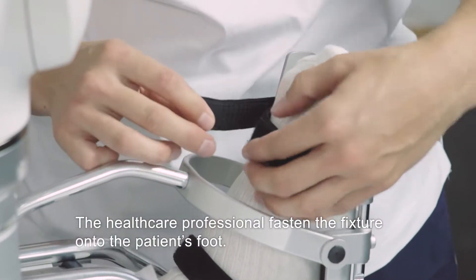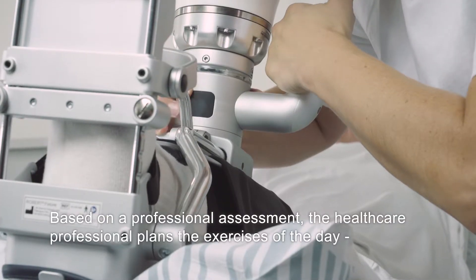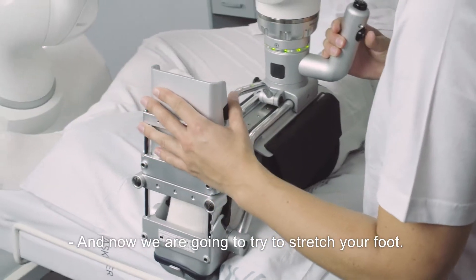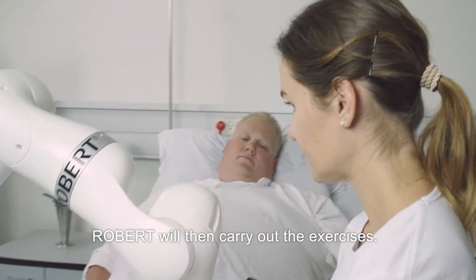The healthcare professional fastens the fixture onto the patient's foot. Based on a professional assessment, the healthcare professional plans the exercises of the day to fit the specific patient. Robert will then carry out the exercises.